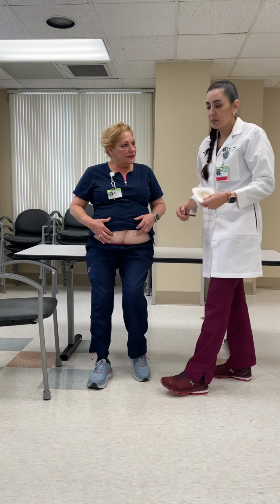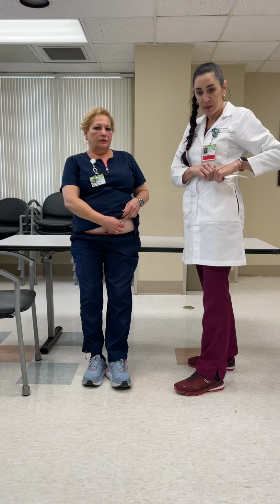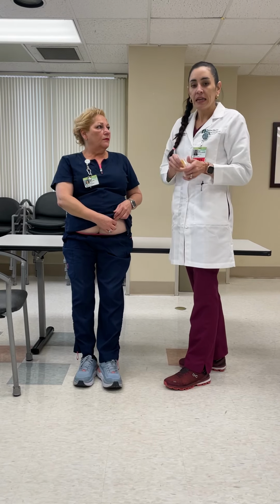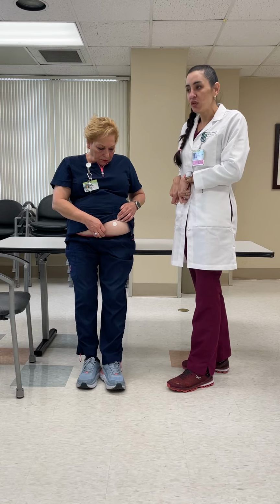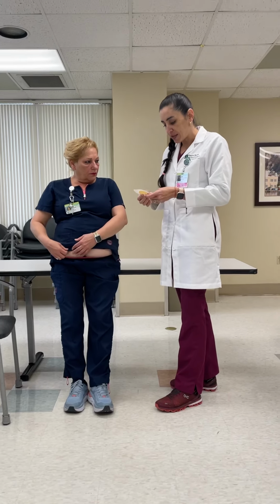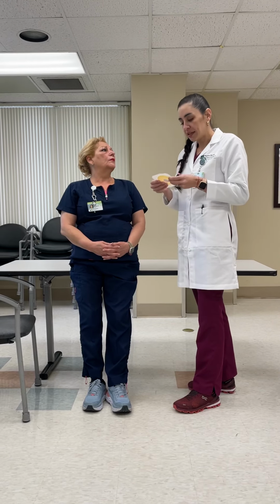So that is important, because for soft tissue, when the patient needs to change the pouch, it's important for the patient to be able to see herself in case she needs to change her pouch by herself. It's important also to mention to the patient that there are different systems.